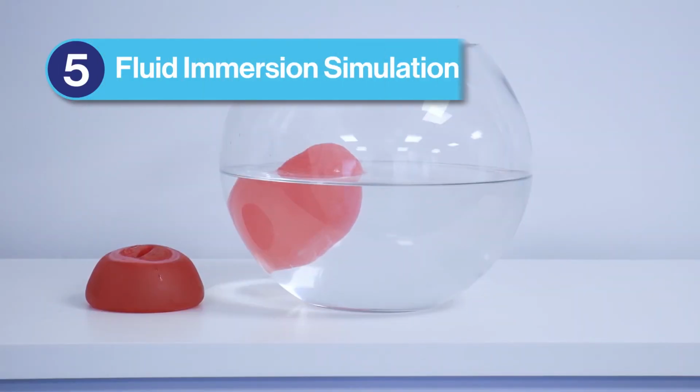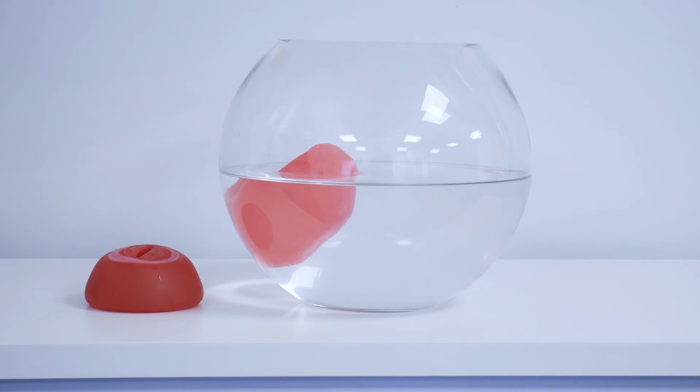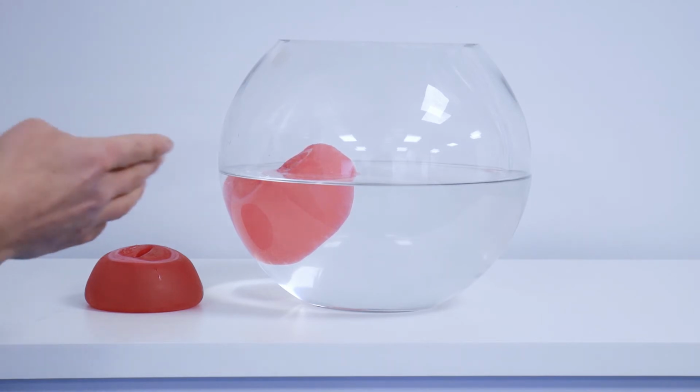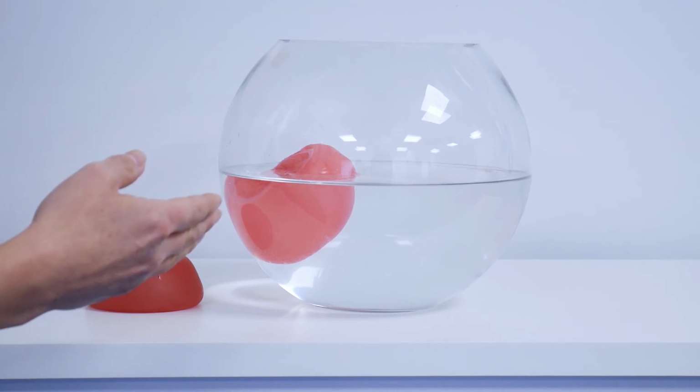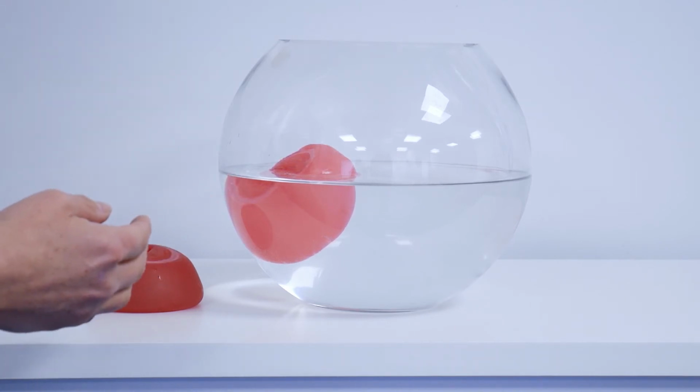Therapies such as fluid immersion and air fluidization may be particularly useful when we have complex patients who are unable to be repositioned for a period of time. Because the most common complication is pressure ulcers, a demonstration like this can explain what the difference is of fluid immersion and air fluidization to tissues.